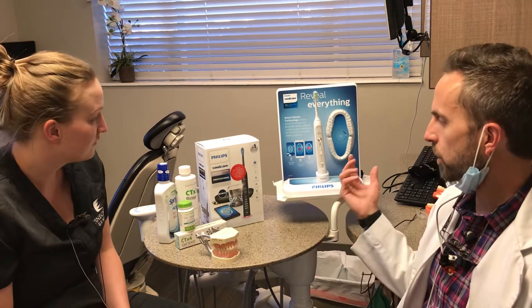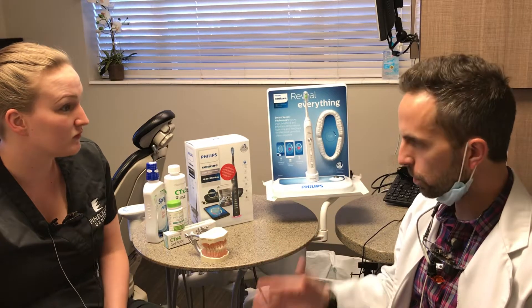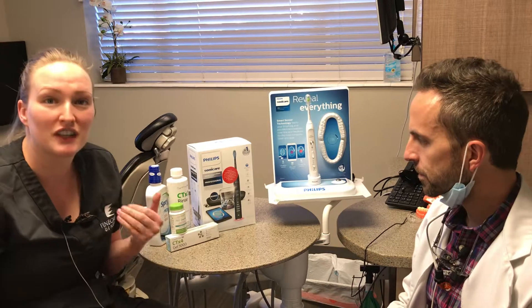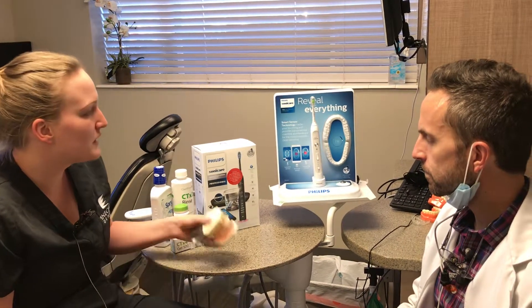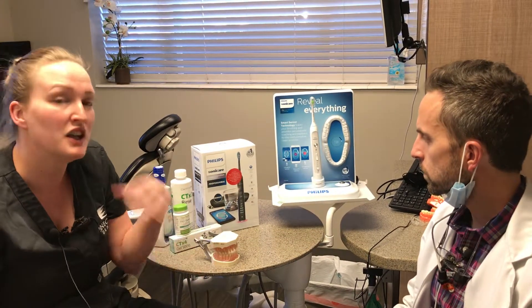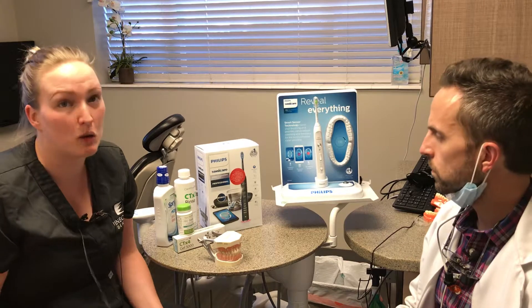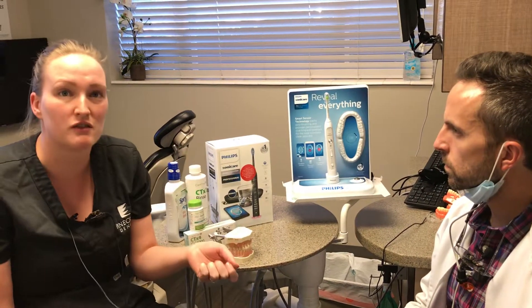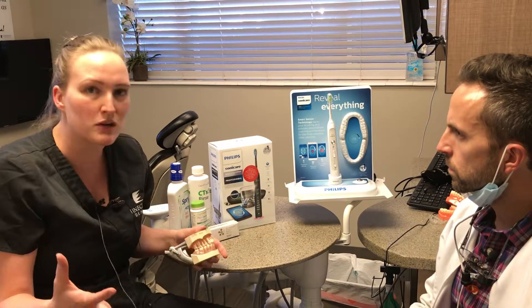So Michaela, tell us a little bit about how to use a Sonicare and what's better about it than a manual brush — the pros, cons, and how it works. Well, I personally also use a Sonicare, and my husband as well, so I'm a big advocate. If you buy one professionally through our office, you get a professional version that's more updated than what you find in stores. It has a lot more settings, it's quieter, and it comes with an app you can link to your phone.